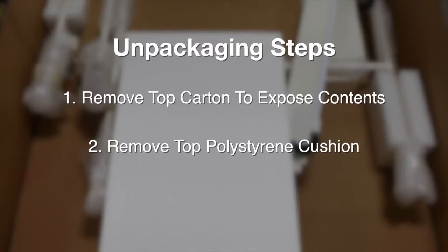The imaging device will arrive in secure packaging such as this. After you remove the top carton to expose the contents, you want to first remove the top polystyrene cushion that secures the generator, and go ahead and set it aside.